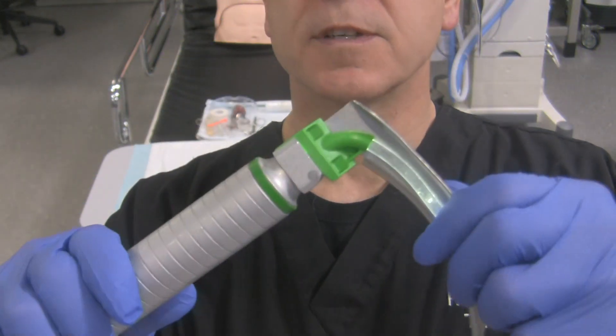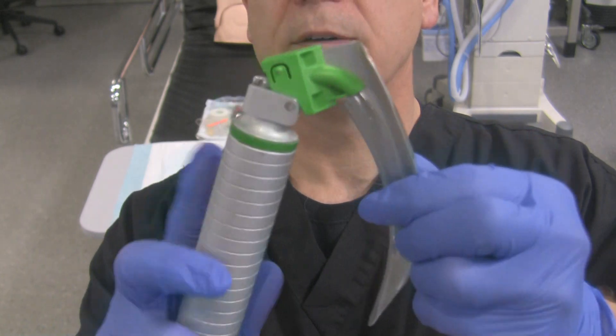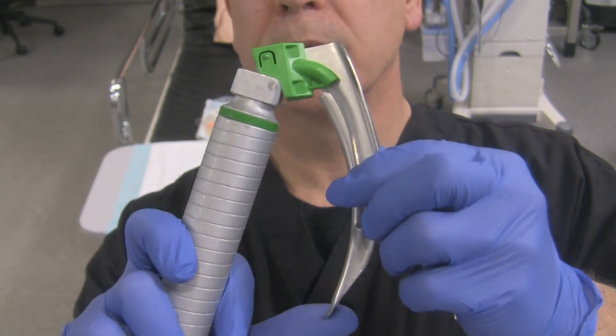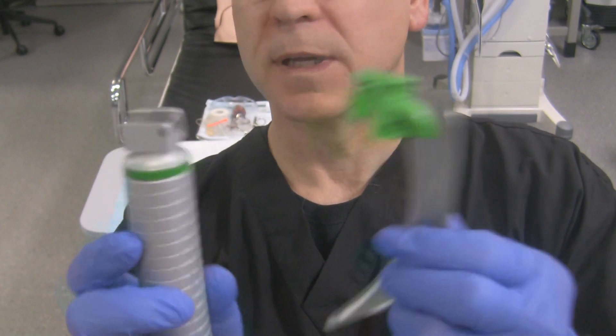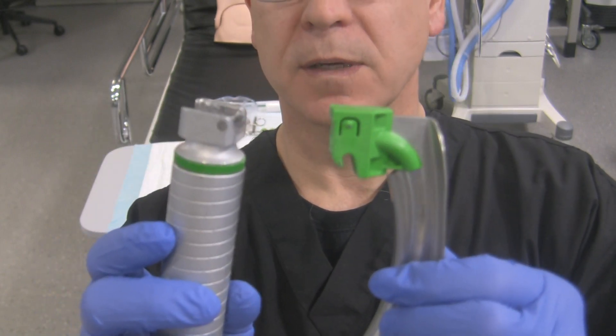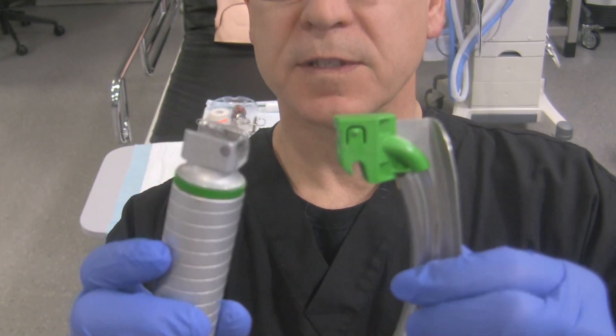To take it off, simply close it off, put your thumb down here, and push the handle off the blade. Nothing comes into contact with your fingers or your hands — it's fairly safe to do it that way.